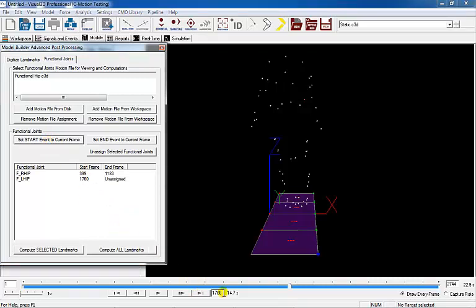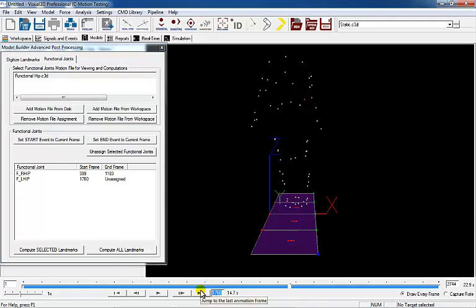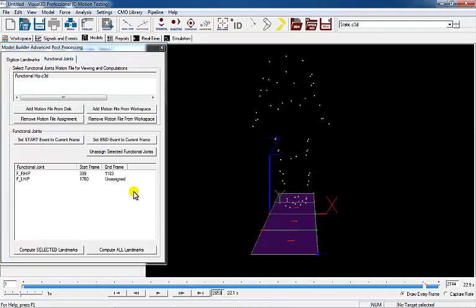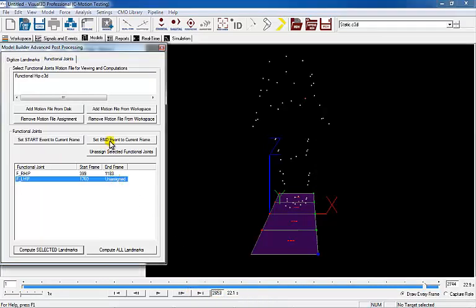Select the end of the left functional hip motion by going to frame 2653, selecting FL hip, and clicking Set End Event to Current Frame.